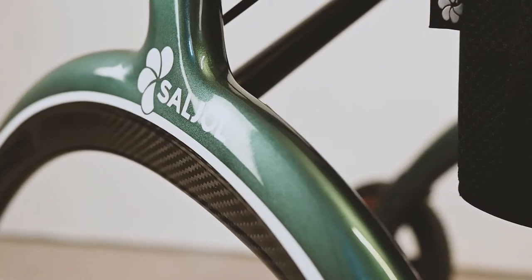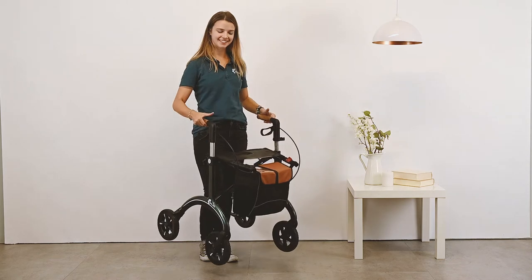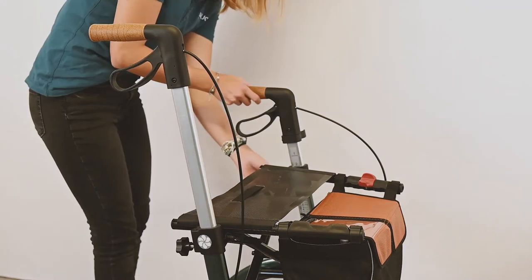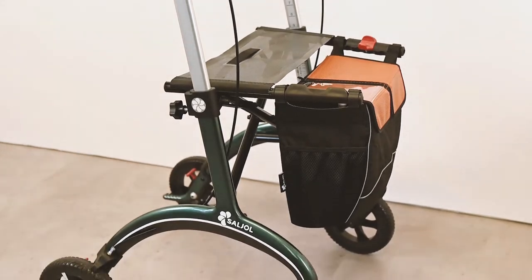Thanks to the high quality carbon material, it is also extremely light at only 5.8 kg. The handles are adjustable up to a height of 103 cm, making the carbon rollator suitable for very tall people.